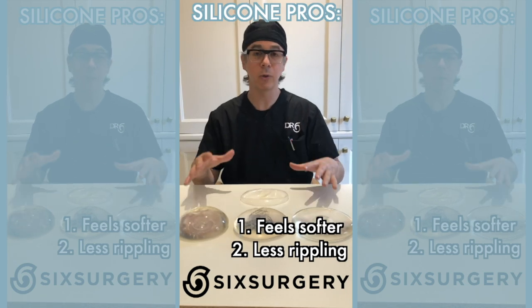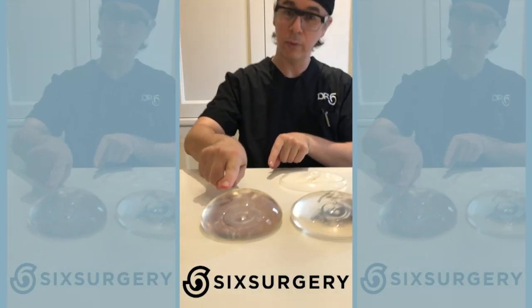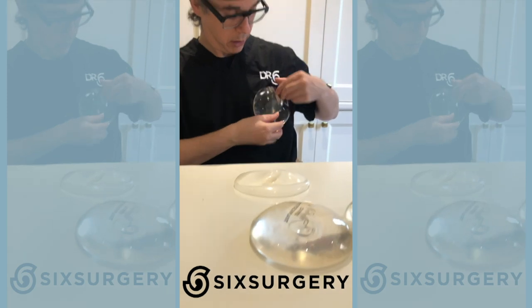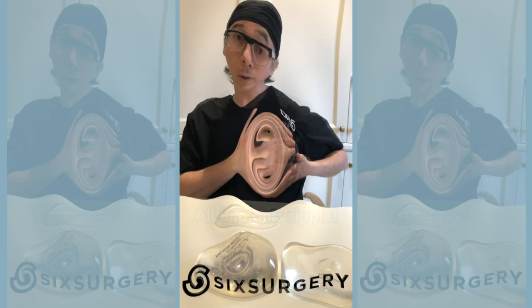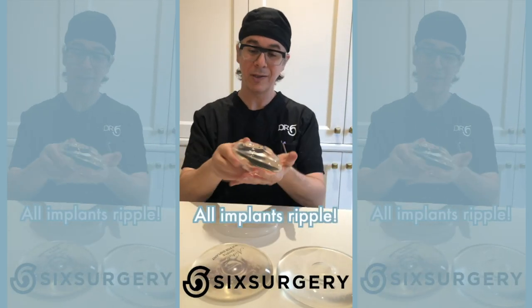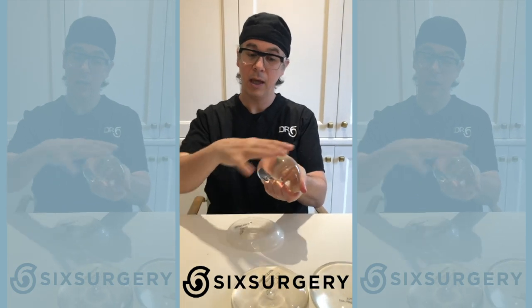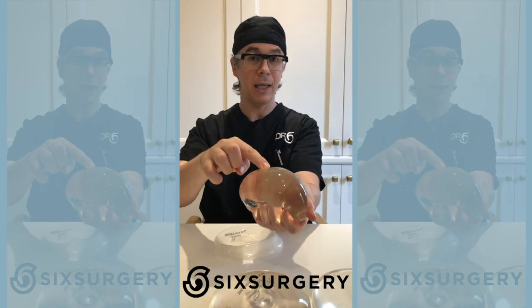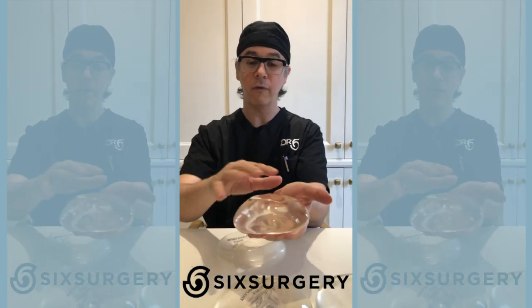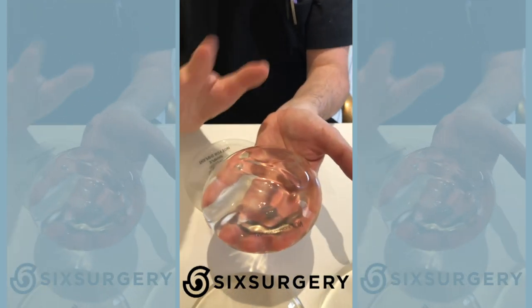People have the misconception that silicone implants have no rippling — there is always rippling. All implants ripple. The reason is that the silicone shell is not fully filled, to keep it nice and soft. If you fill it fully it becomes beautifully smooth but also hard. So implants are slightly under-filled to stay soft, and the price you pay is some rippling, present in all implants.